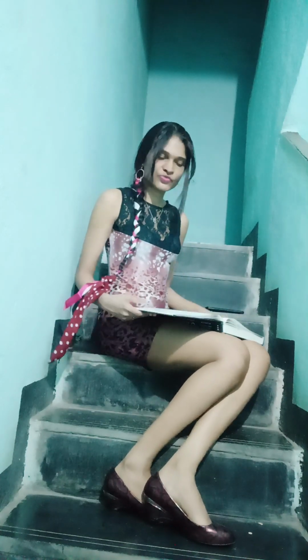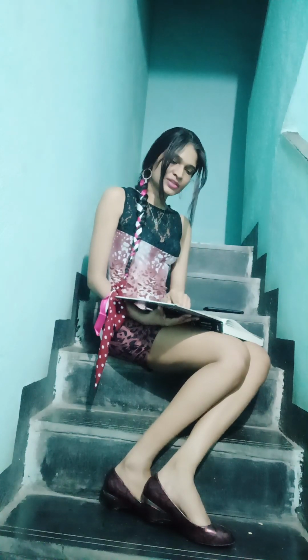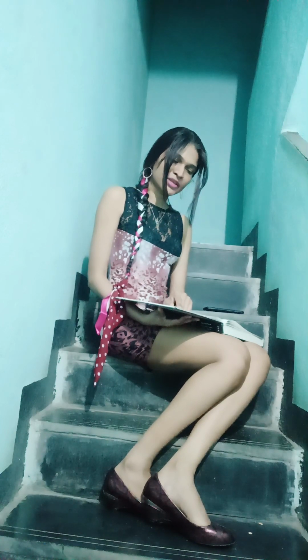Now figure 3.1, principle of gonioscopy. A. A light ray is refracted when angle of incidence I at interface of two media with different indices of refraction n and n dash is less than the critical angle. B. Angle of refraction R is 90 degrees when I equals the critical angle. C. Light is reflected when I exceeds the critical angle. D. Light from the anterior chamber angle exceeds the critical angle at the cornea-air interface and is reflected back into the eye. E and F.